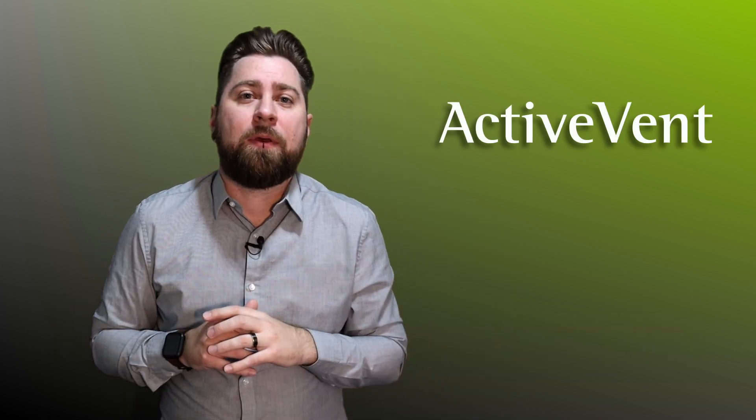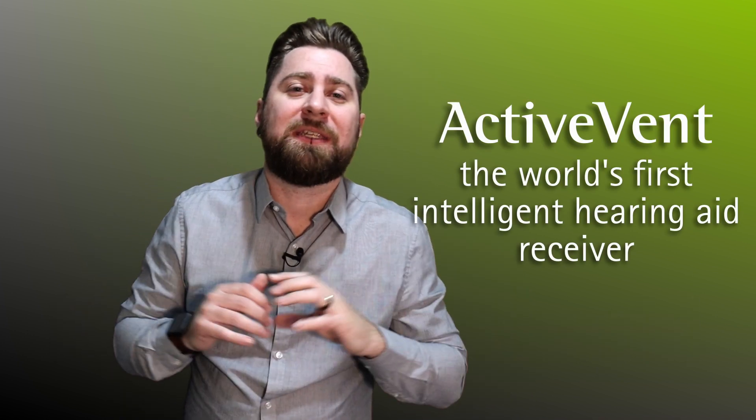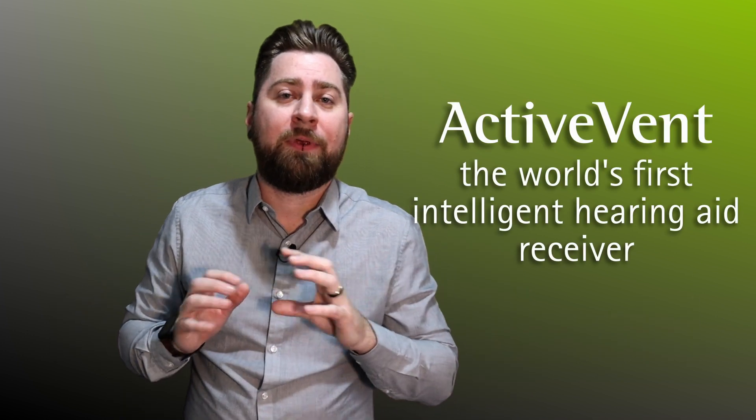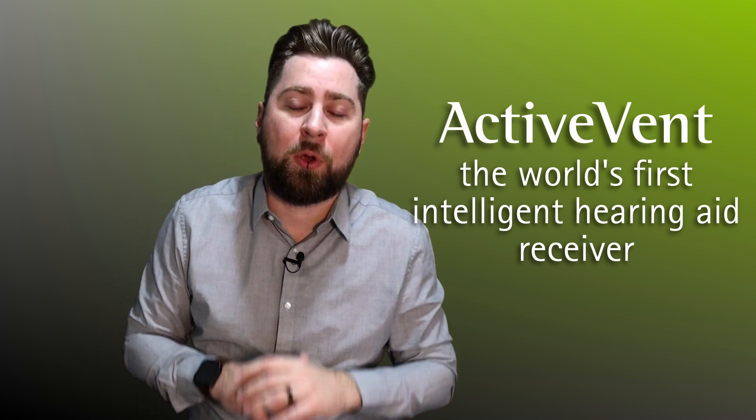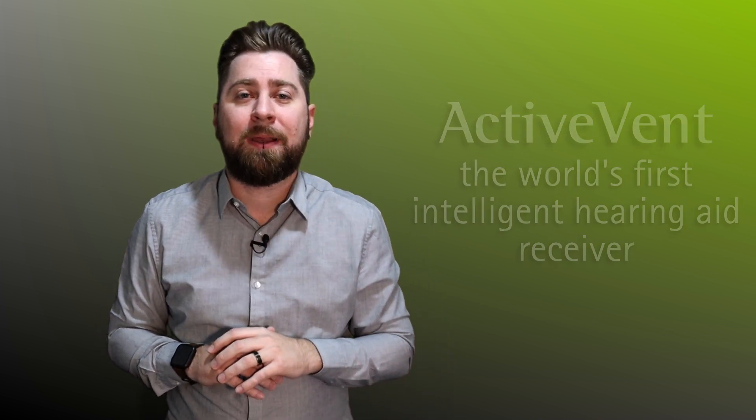And this is where ActiveVent, the world's first intelligent hearing aid receiver, comes in to help solve the problem. ActiveVent is a brand new type of receiver or speaker which is compatible with Phonak's Audeo Paradise rechargeable hearing devices. The ActiveVent receiver includes a mechanical vent which can snap shut or open up depending on the classified sound environment, settings of manual programs, or in the presence of streamed content.